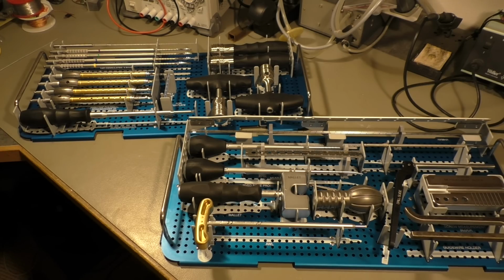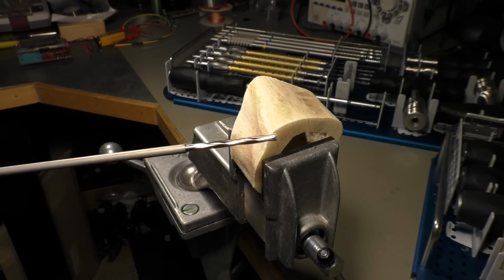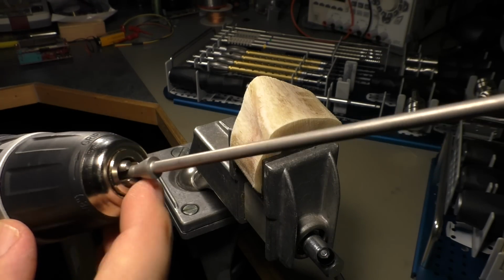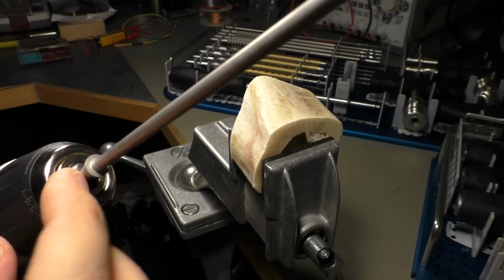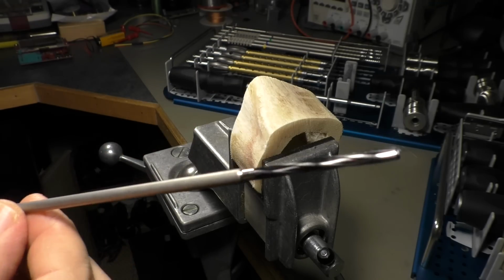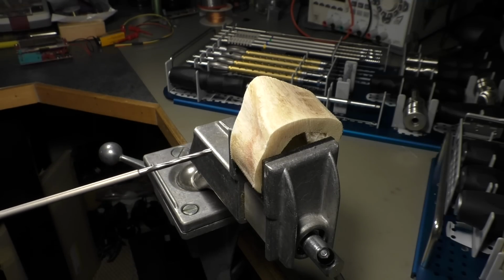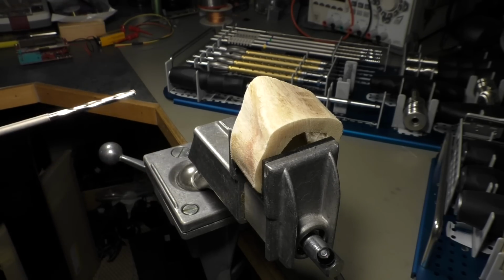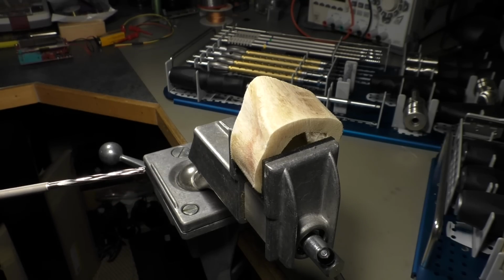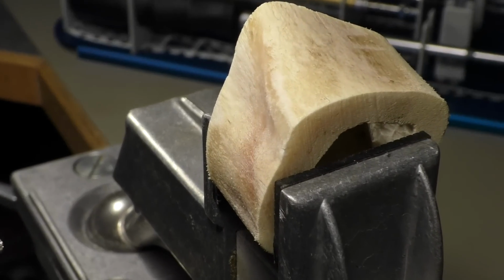Okay, so let's try it out. Let's drill a hole into a bone. I have already prepared my electric drill with one of these drill bits. It was not super easy because these drill bits are not made to be held with a simple three-jaw bit holder, so they need a special attachment. I don't have that, but it runs pretty straight now, and I want to try to drill a hole into that soup bone here. It's a beef bone for a soup, so I made some soup today and that was left over.